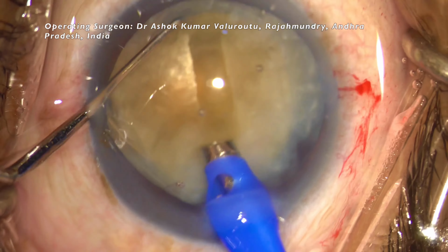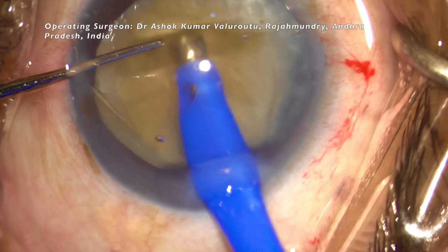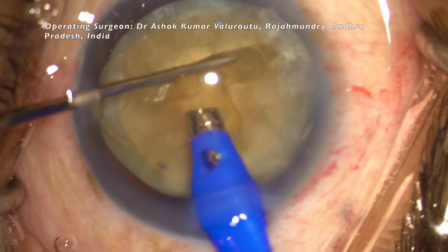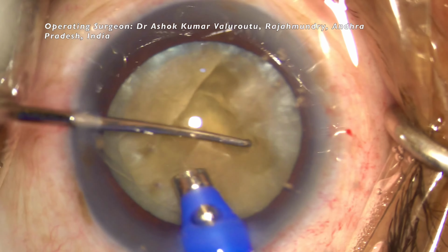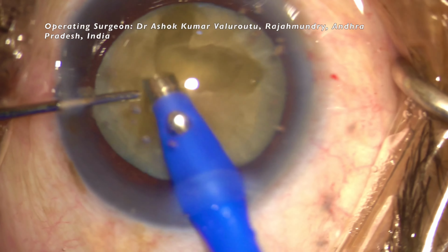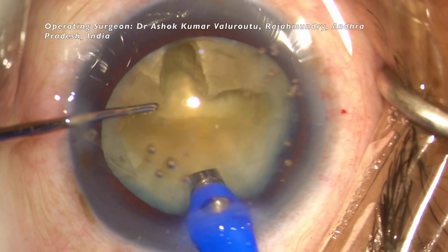Now we could see the trenching. The trenching in this scenario is done with a higher energy level. Here I am using 80% of phaco energy. You could see the trench is properly done. Now the main trench is done, the accessory trench is done. So we could see that the plus sign of a proper trench is done in this scenario.